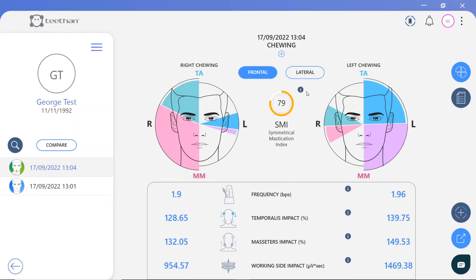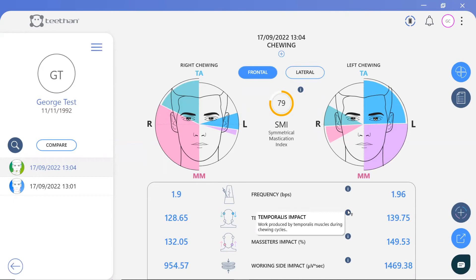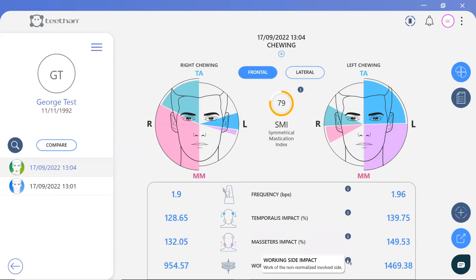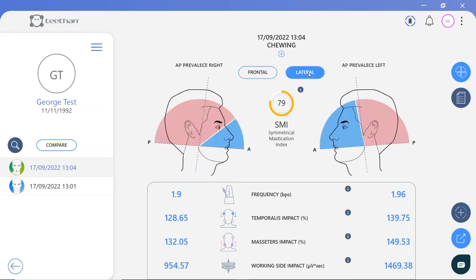This patient has only scored 79%. In the frontal plane, we can see that the left chewing is well balanced, but there is a prevalence of the right masseter when chewing. In addition to the graphical pie charts, some numerical indices are calculated for the left and right side. Frequency represents the number of chewing acts per second. Temporalis and masseter impact displays the work produced by the respective muscles during the chewing cycles. Working side impact is the non-normalised muscular work of the left and right side during the test execution.